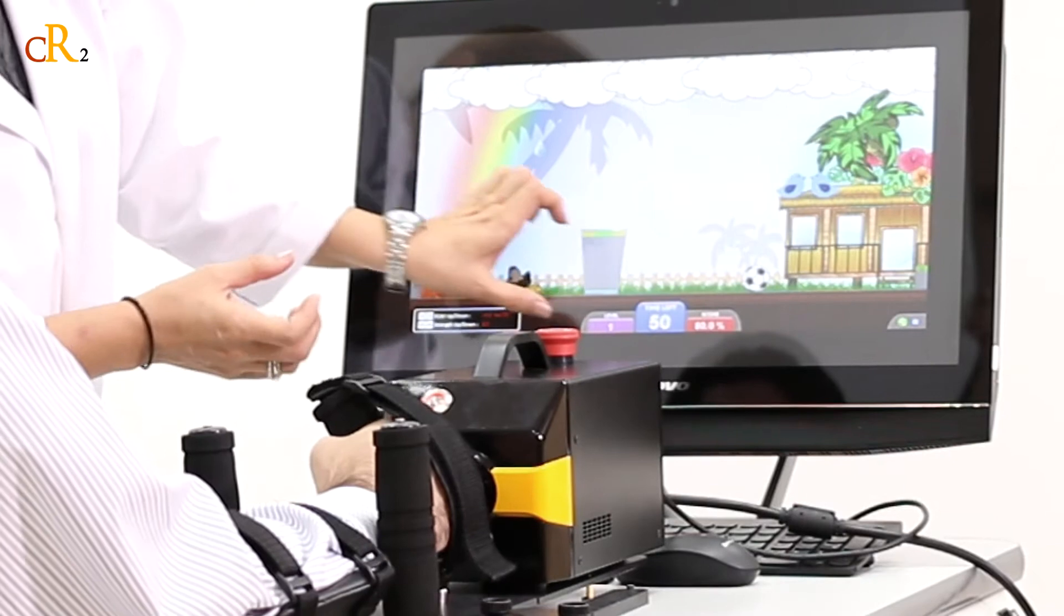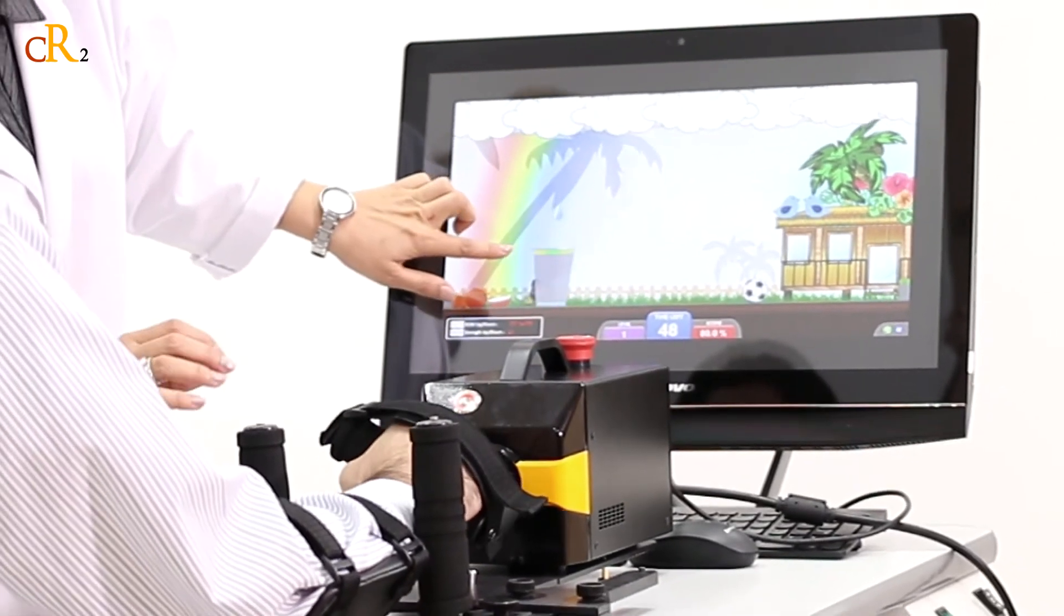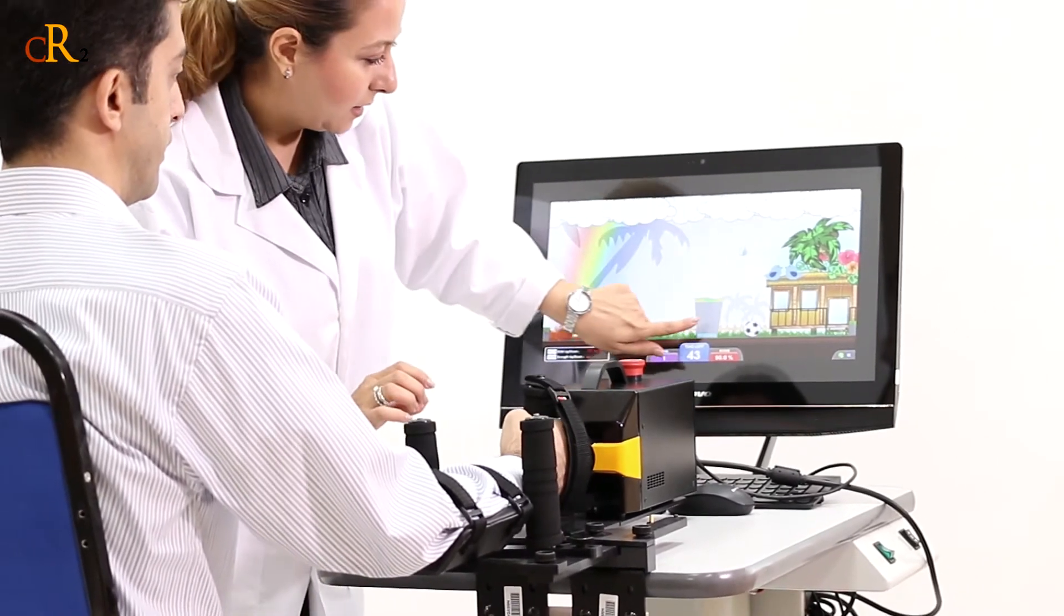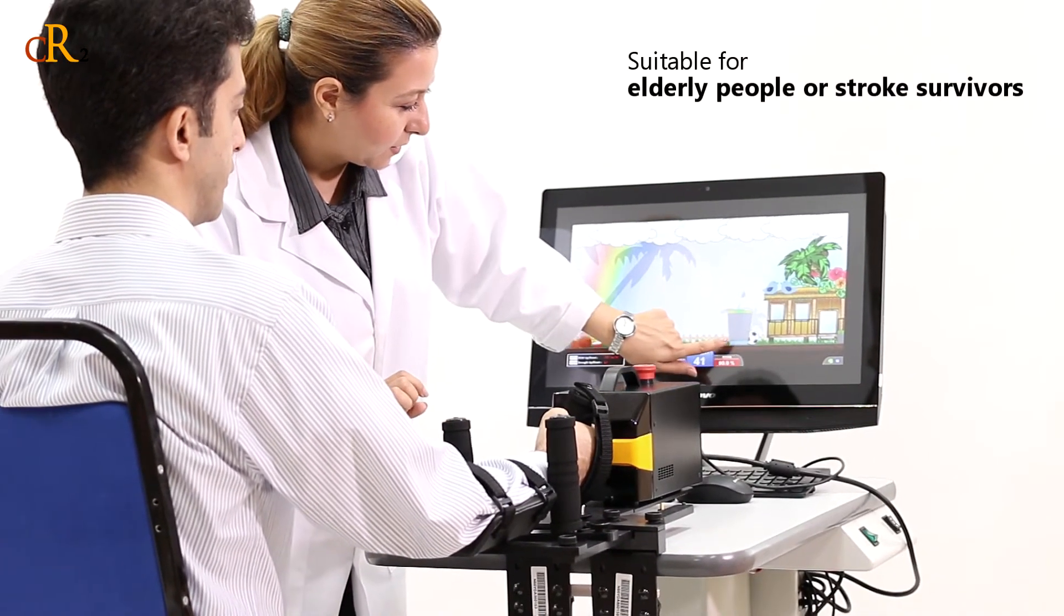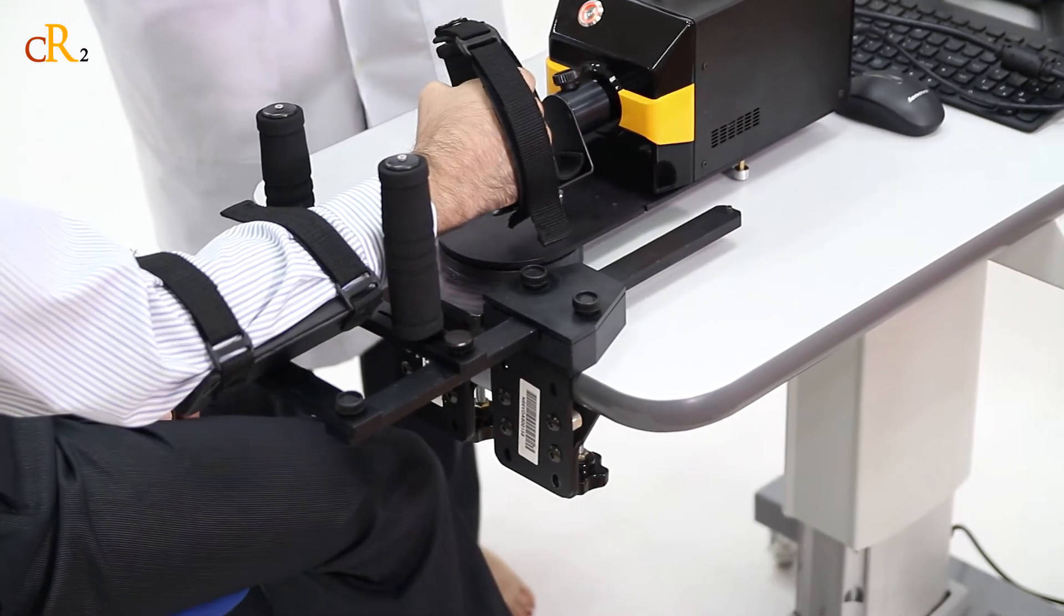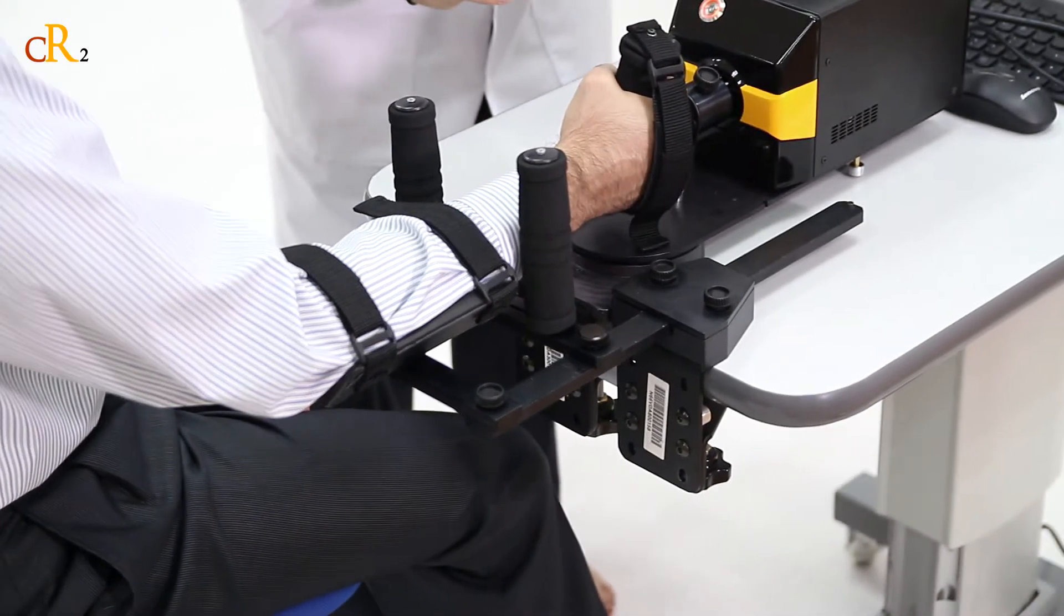The robot provides assistance when needed and resistance to strengthen muscles as users improve. The device can be used by elderly people, stroke survivors, and others who need rehabilitation training or exercises for the hand.